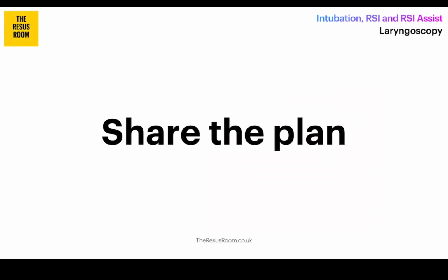So first up, we need to make sure that we've discussed the plan and the approach that we're going to take as a team. We'll talk about cardiac arrest here to start with, and then consolidate on that by running through an RSI towards the end. And we'll be talking about the two options in this section of direct laryngoscopy and video laryngoscopy with a standard geometry blade. But we'll start off with direct laryngoscopy.